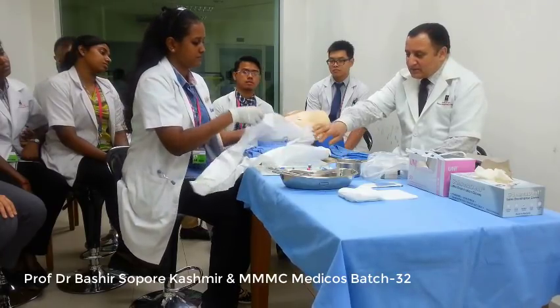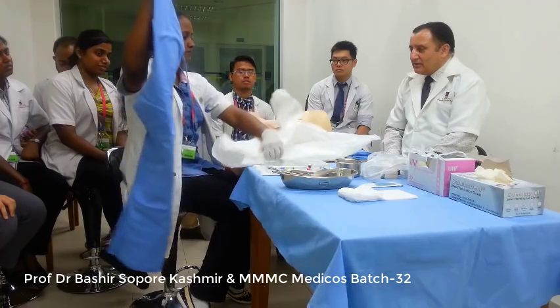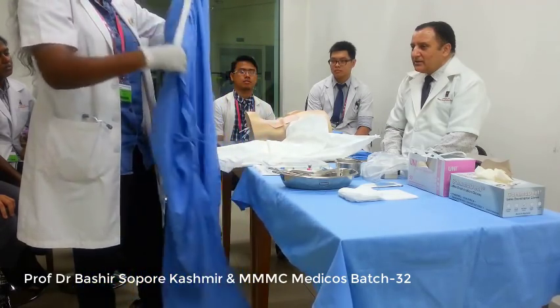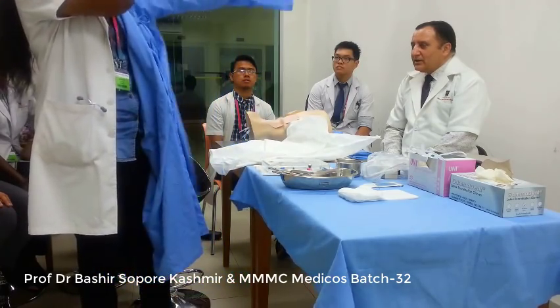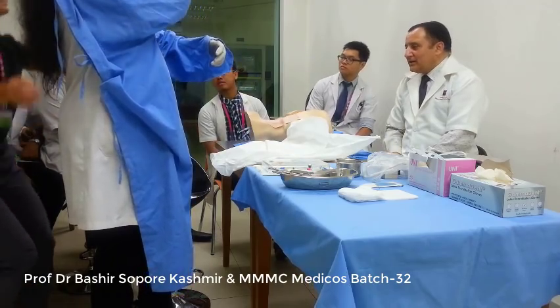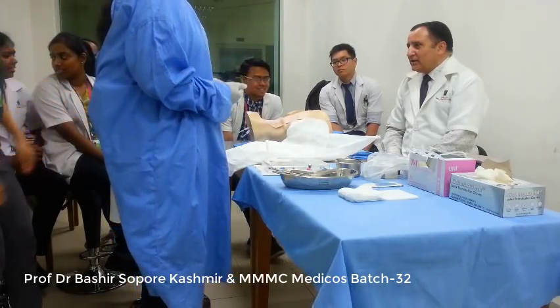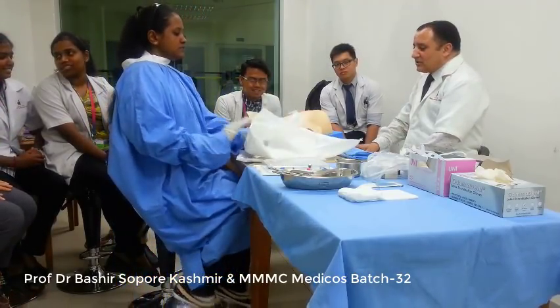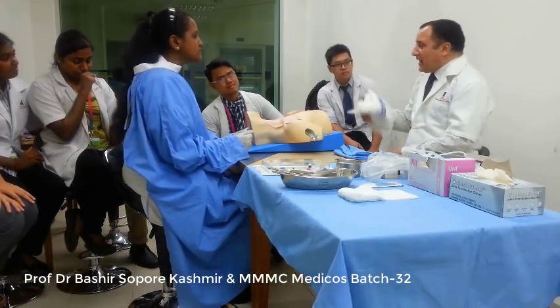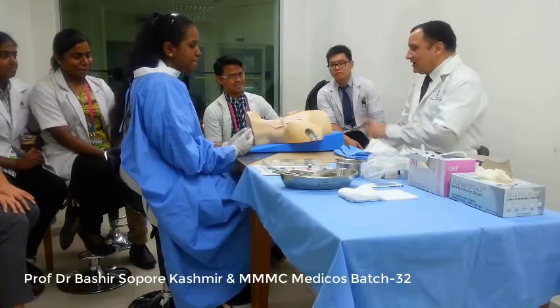Let me help you. So you have to put on the sterile gown, yes, that's right, and you will also put on the face mask and cap to cover the hair, because sometimes the hair can touch the patient's fluids and you may get infection.